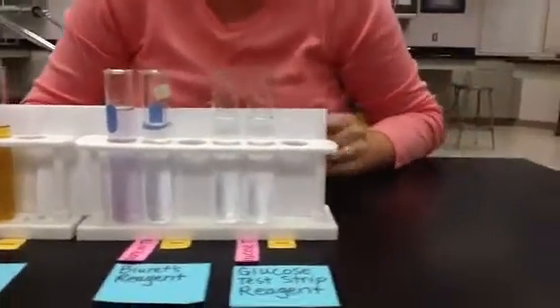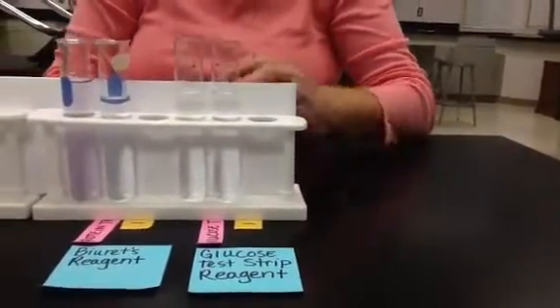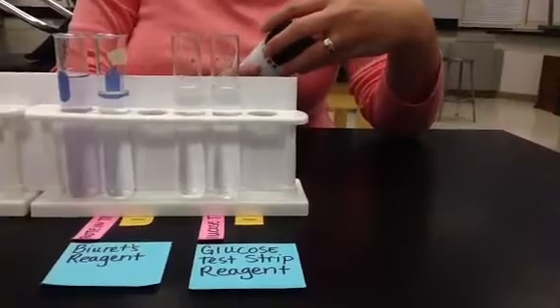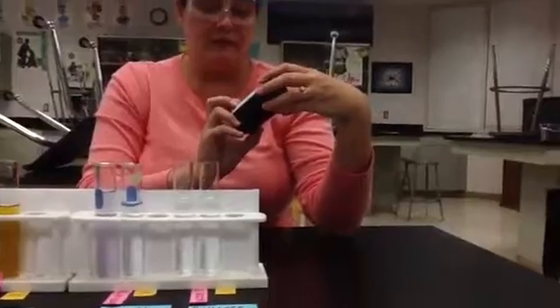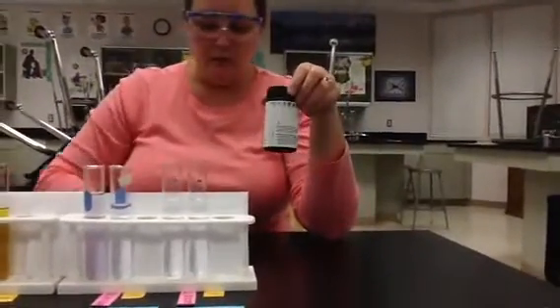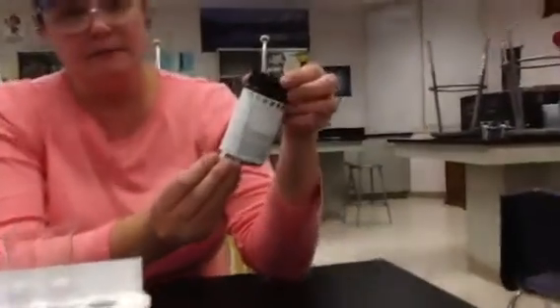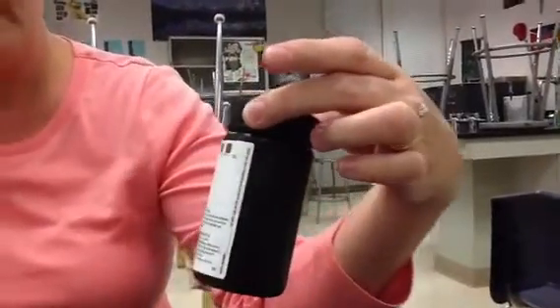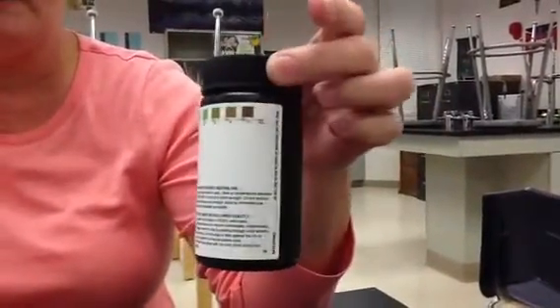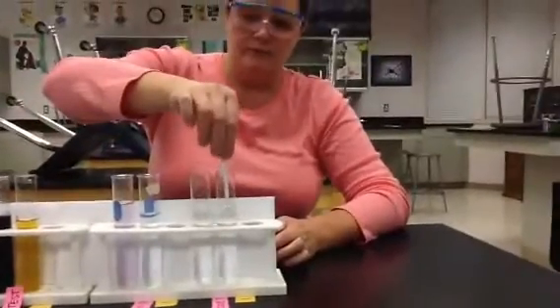The last one we're going to do is our glucose test, and that again is a sugar. So we have these special strips called urinalysis test strips, and they actually test for the presence of glucose in them. So I have a strip here, and a negative test is this light blue. And anything that changes beyond that, from that light green to brown, is considered a positive test. So we're going to dip our first one into the negative one, and it should stay hopefully blue.